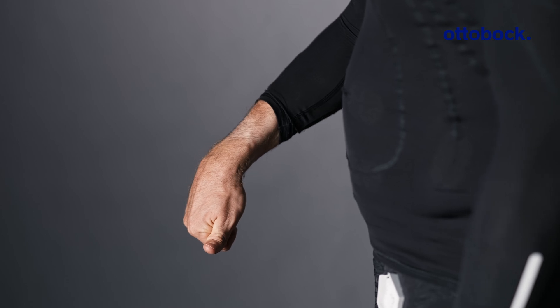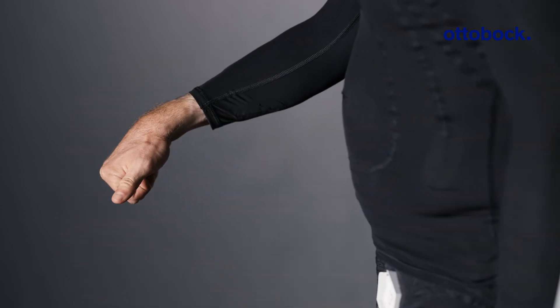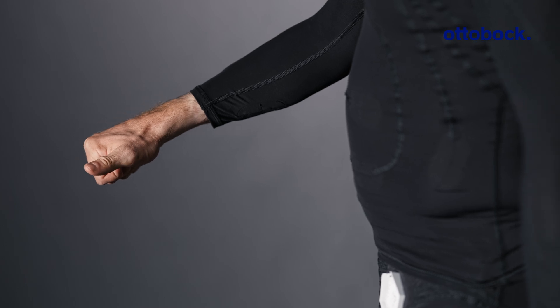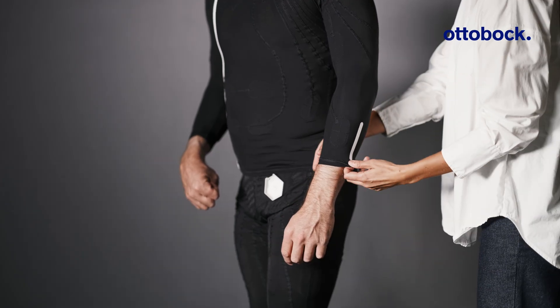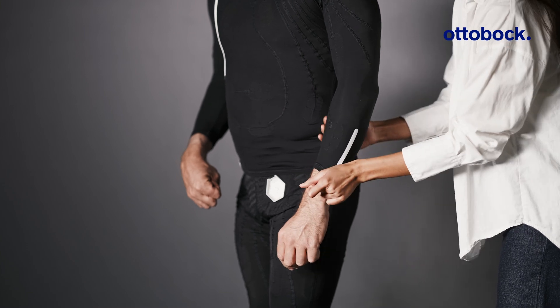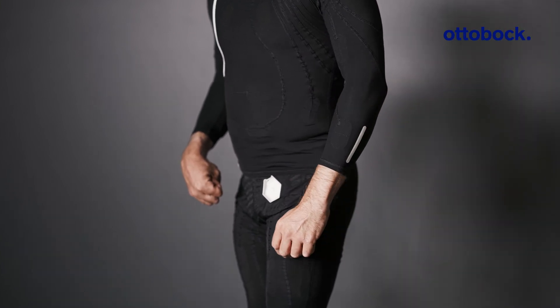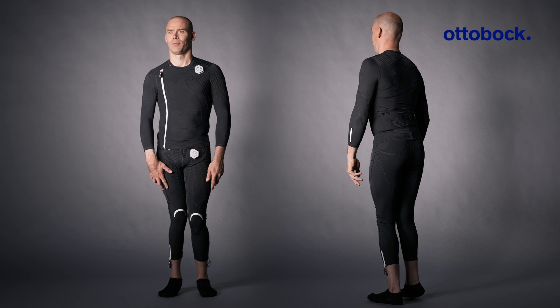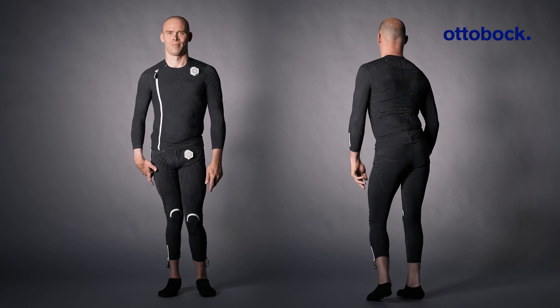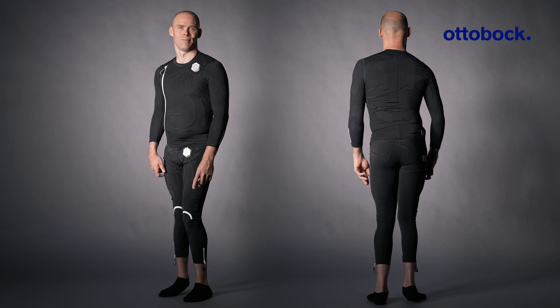Adjust the arm placement so that the arm inseam runs in a straight line from the armpit to the thumb, and so that the white guideline runs straight and parallel to the outer part of the forearm between the elbow and the little finger. Make sure the garment has a body-tight fit without being constricting so that all electrodes maintain proper skin contact.